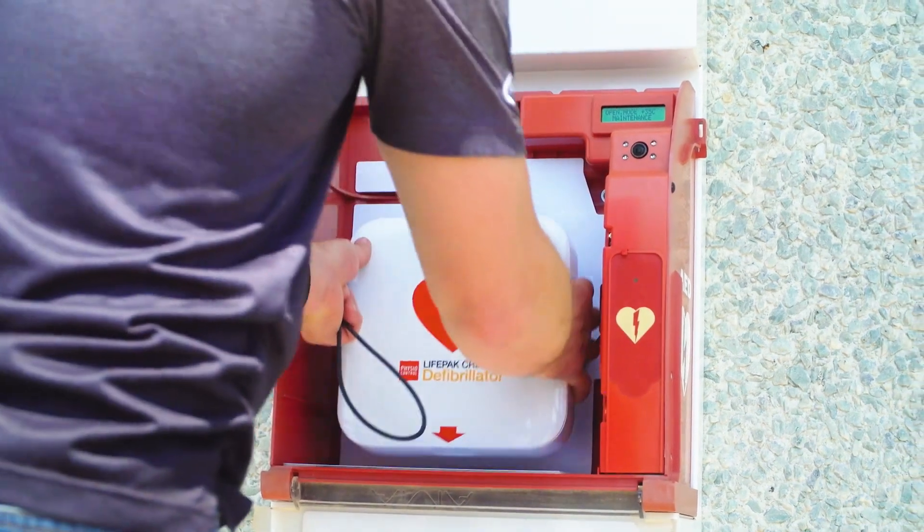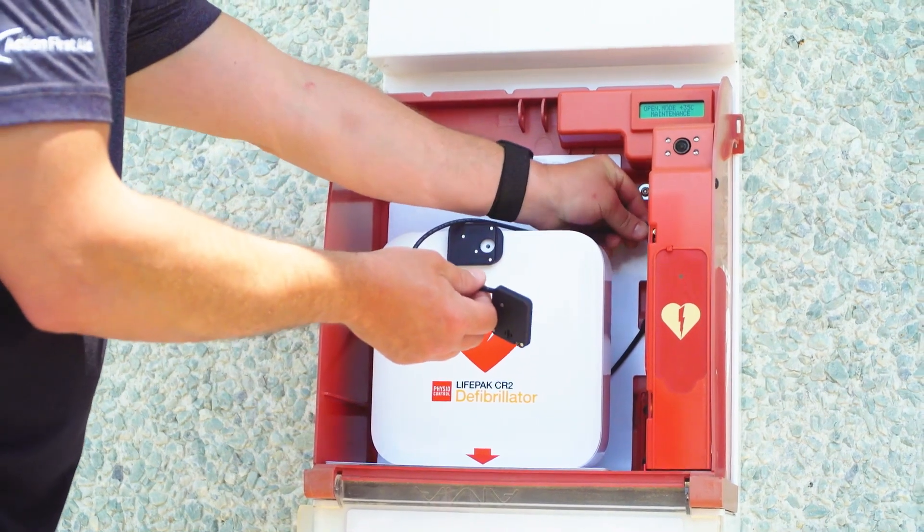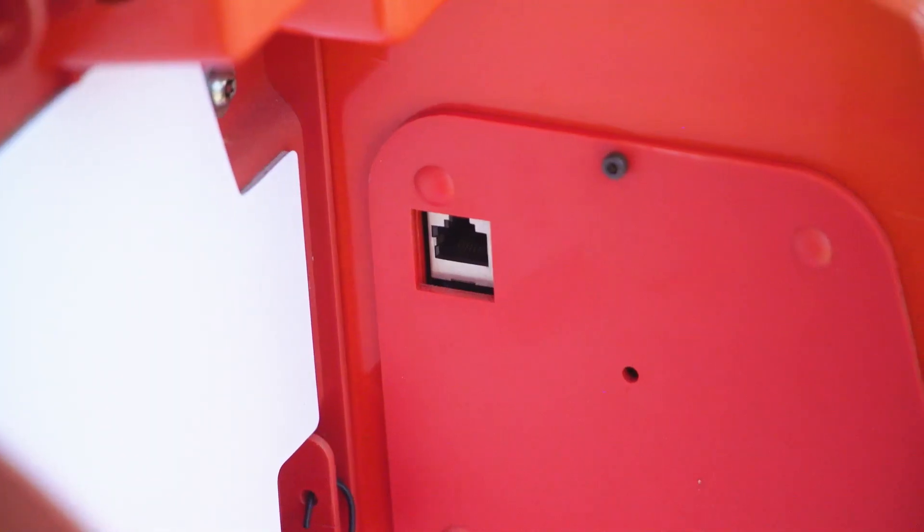Place the AED with the sensor base attached inside the cabinet. Plug the optical sensor into the port on the inner right side of the cabinet.